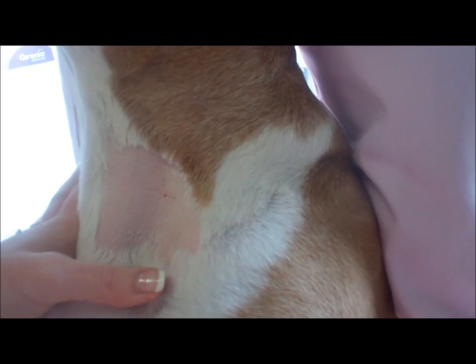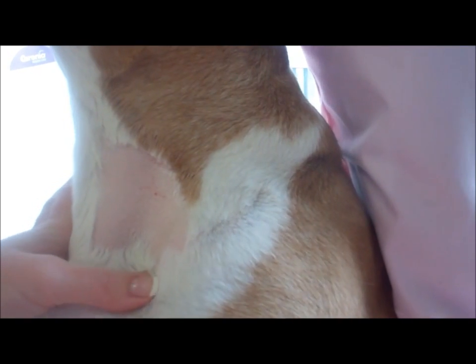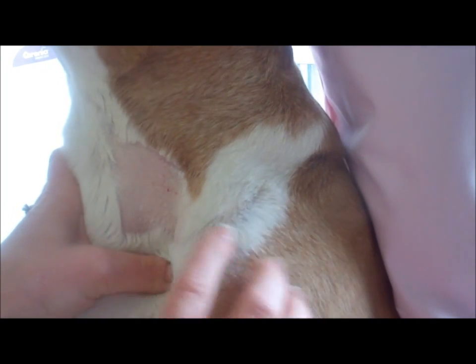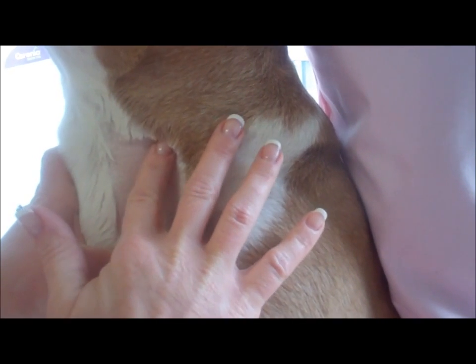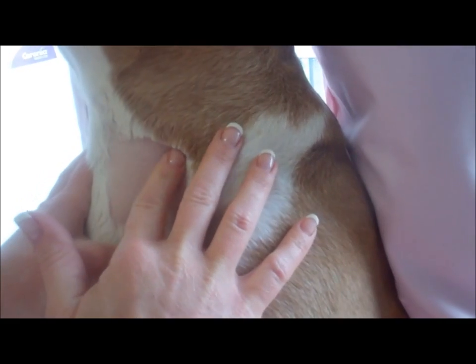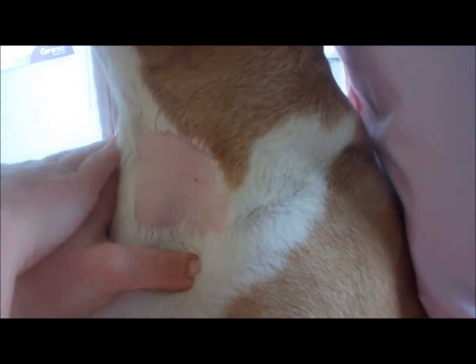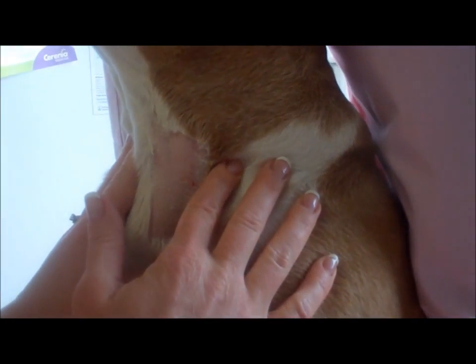You should be able to feel the vein once you get better at the technique. Again, if I push in and up, it fills. I'm also trying to pull the skin away slightly on this side because it tends to want to fold in.